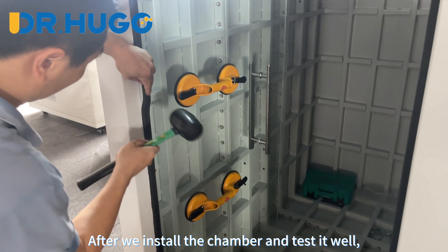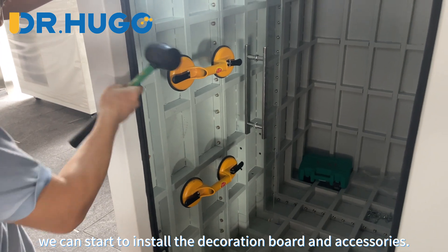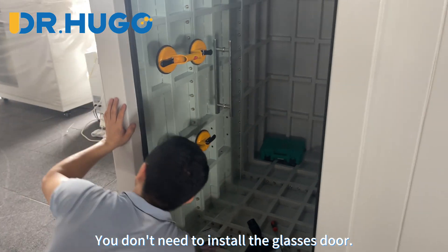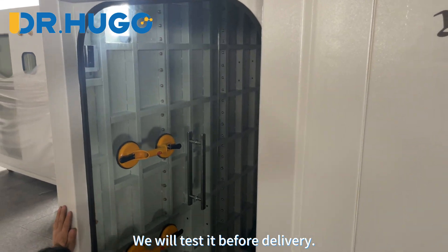After we install the chamber and test it well, we can start to install the decoration board and accessories. You don't need to install the glass door — we will install the glass door and ceiling strips, and test it before delivery.